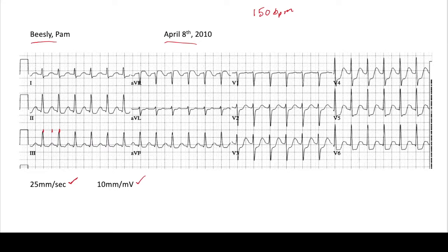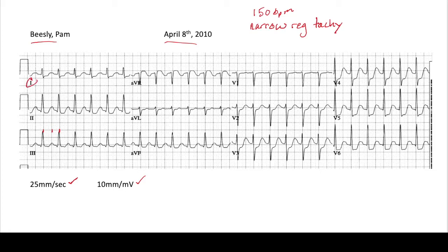Next, we determine the rhythm. We already noted that it's fast, so it's a tachycardia. Now, is the QRS narrow or wide? We see that it's narrow. So it's a narrow complex tachycardia. And is it beating regularly or irregularly? We see that the intervals are regular. So this is a narrow complex regular tachycardia. In the tachycardia lectures we'll talk about what these types can be, but right now we know this is a narrow regular complex tachycardia. So we have the rate, we have the rhythm. Next, let's look at axis.